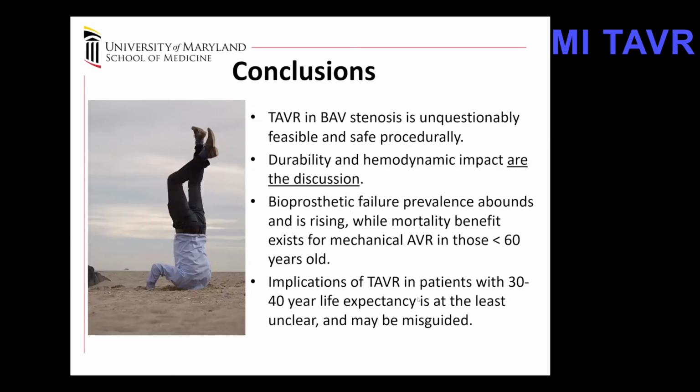So in conclusion, I would not want to debate the point that TAVR is feasible, safe, demonstrating early and midterm results that are equivalent. I think the jury has concluded on that point, and there's little debate that TAVR is safe in this population. I think we're missing the mark, though, in thinking that is the discussion.